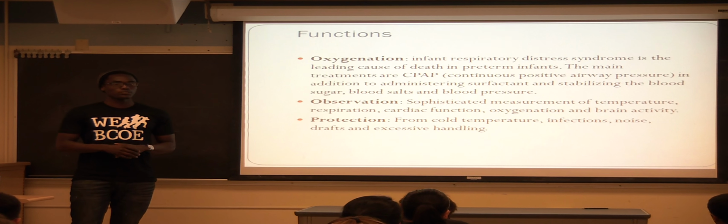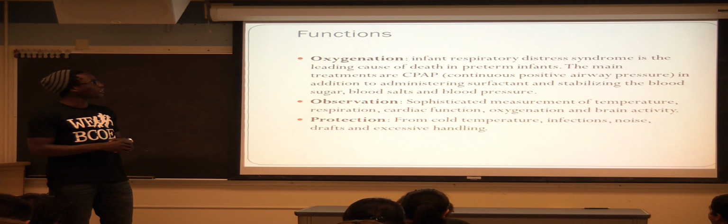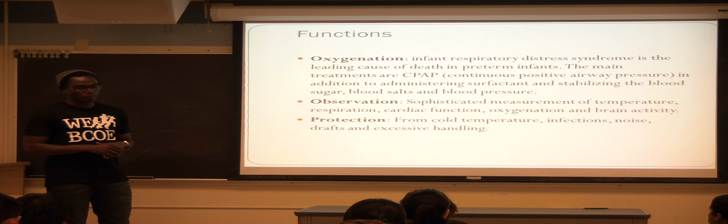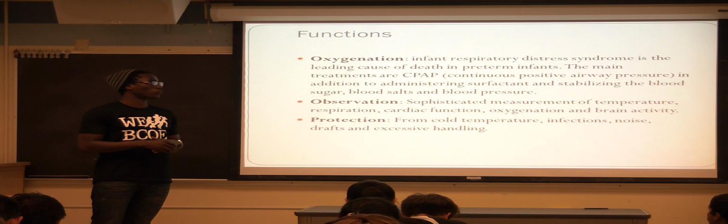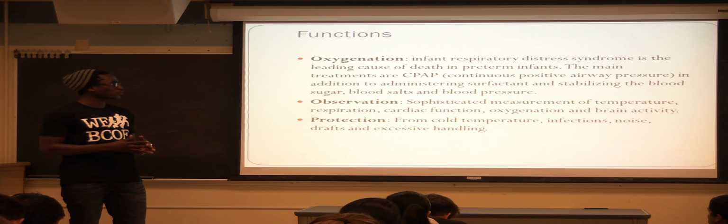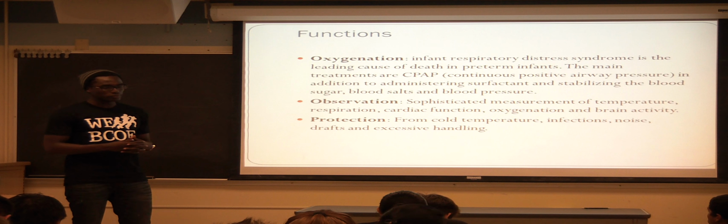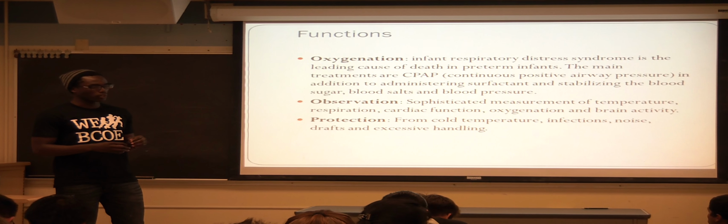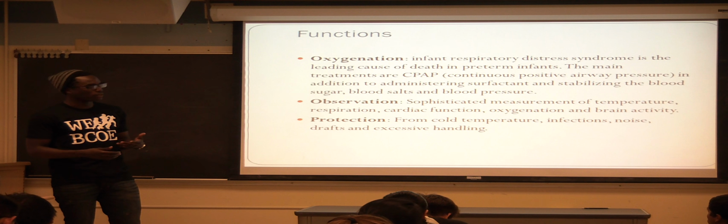Under oxygenation, the reason why the NICU was actually invented was because before the 1900s, most kids were dying of infant respiratory distress, as in they couldn't breathe by the time they were born. When they are born, they're out of the mother's womb and their system is not fully developed, so they can't really breathe well. So the NICU provides continuous positive airway pressure, in which clean oxygen is pumped into the infant's lungs, and they can breathe properly.